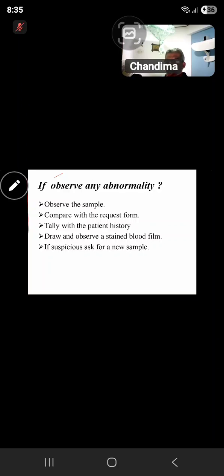Right. Sometimes there may be a relationship, if giant platelets are actually present in the patient's blood film. But in some conditions which I have mentioned, where platelet aggregation is present, the relationship is not going to be there. If actual giant platelets are present, the relationship is there. But if giant platelet aggregation is there, the relationship is not there, right?